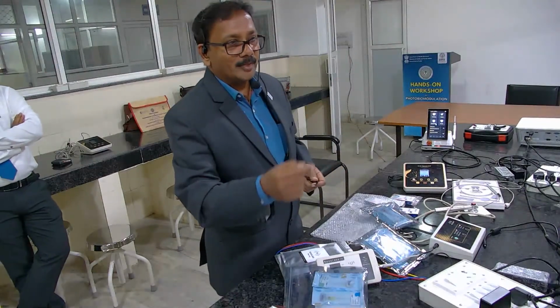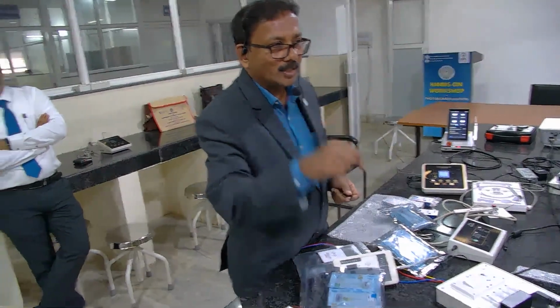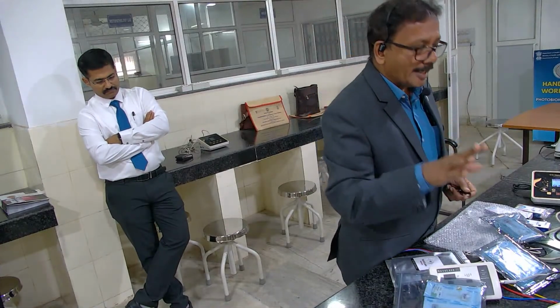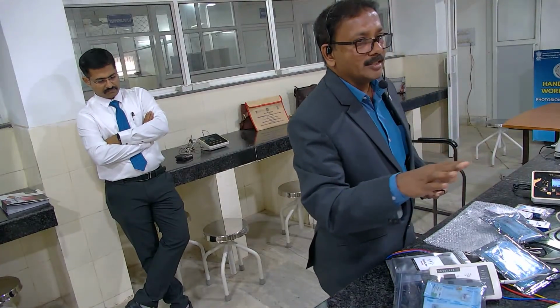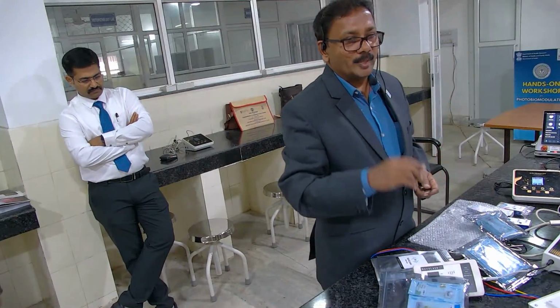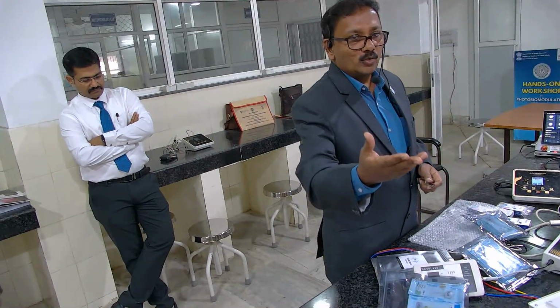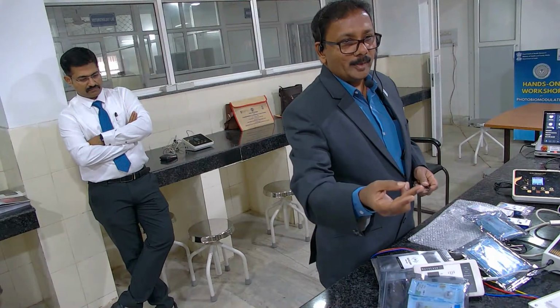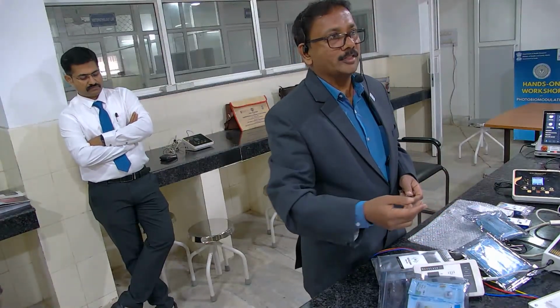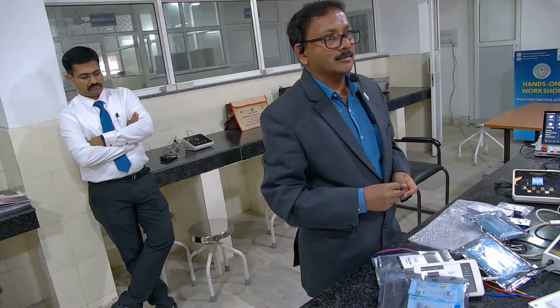Go for photodynamic therapy: introduce 1 or 2 drops of dye and then irradiate, so that the bacteria hiding there, E. faecalis or any organisms, get coated, and your light is enough to kill those bacteria. As I told you, 50 to 100 microns of sodium hypochlorite versus 1000 microns of photodynamic therapy. The choice is yours, choose your heroes.